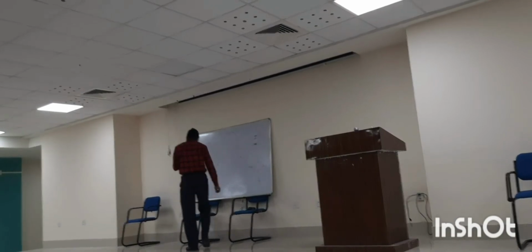Now let's draw. The electrocardiogram machine is so designed that the paper speed is 25 millimeter per second, and 1 millivolt of deflection is represented by 10 small squares of the tracing paper.